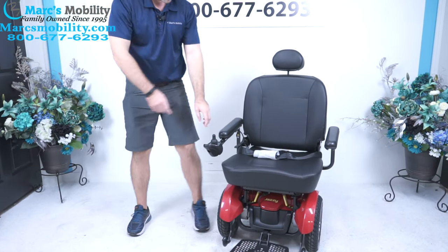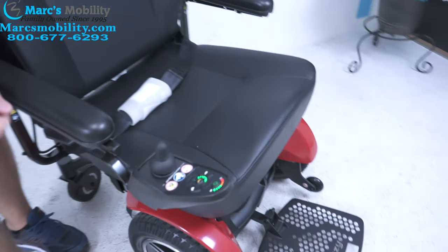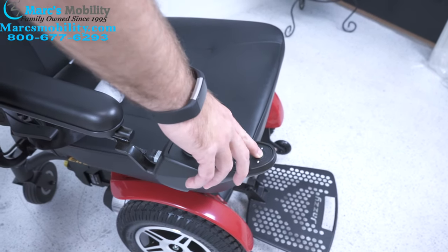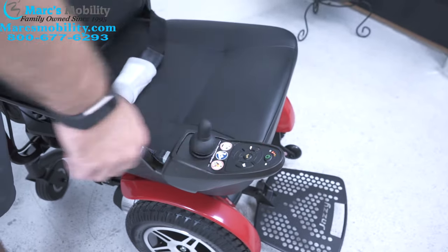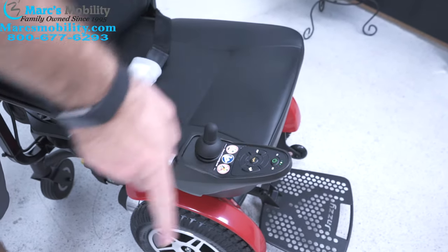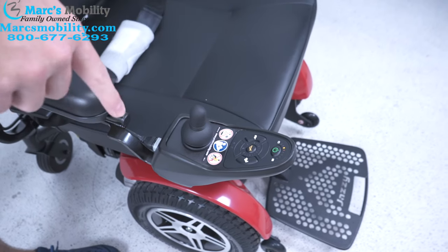A common mistake that a lot of people do with these units is when they go to turn them off, they hold their finger down on the joystick. What happens is if you hold your finger down on the joystick when you're turning it off, you'll hear a beep. When you go to turn it back on, your lights are scrolling. If your lights are just scrolling and you do not have a flashing symbol on here, you've locked out your chair.